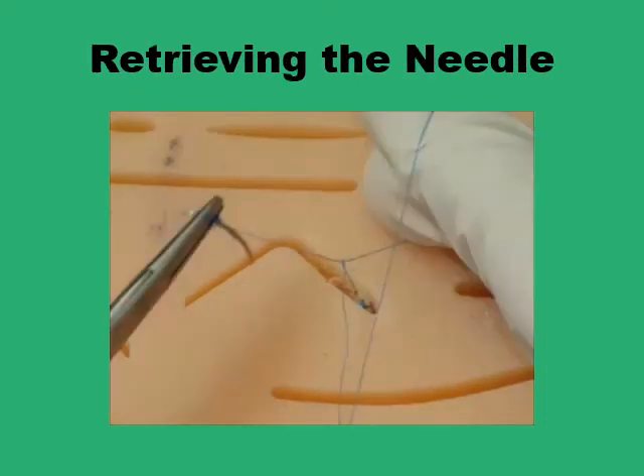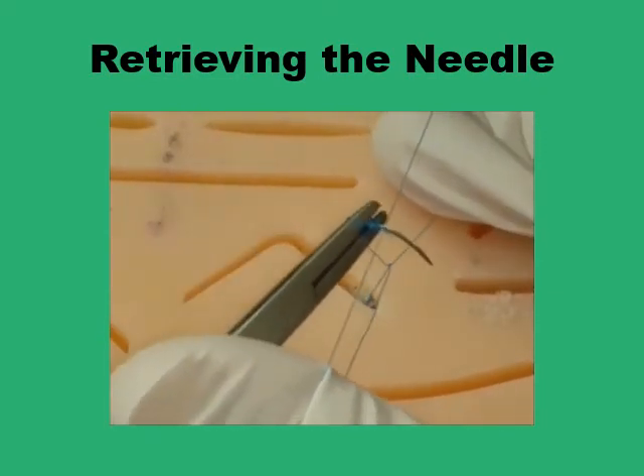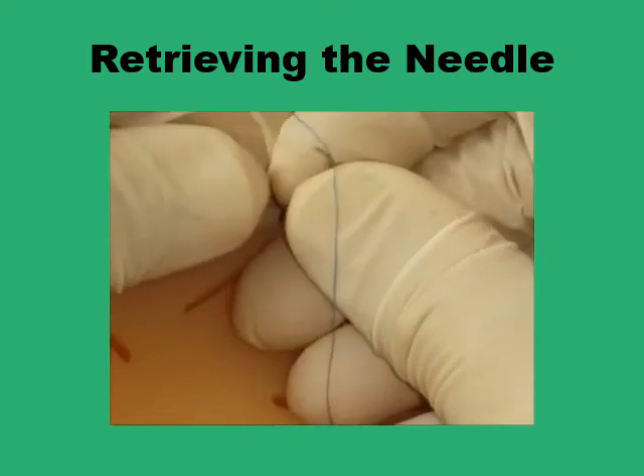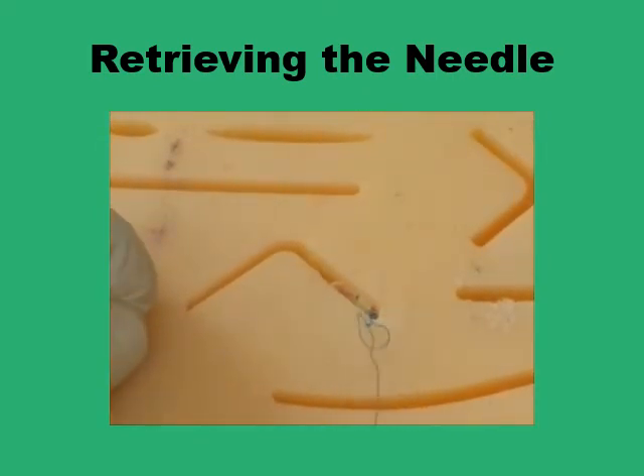Once you are happy with the security of your knot, you pull the needle through the final loop — the last loop that you have formed — and pull on the thread. You've got a secure knot tied in the depth of the tissues in the subcutaneous area.